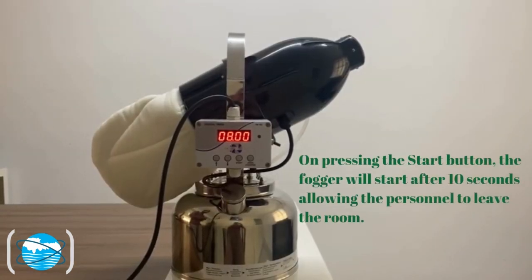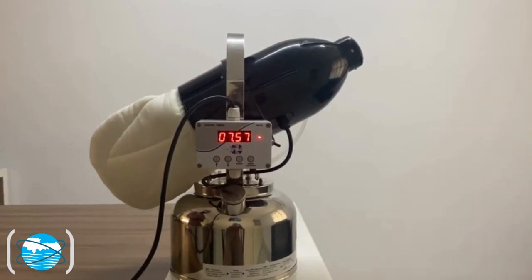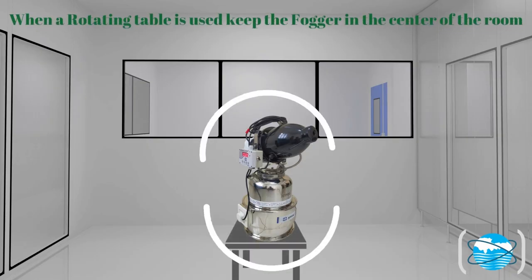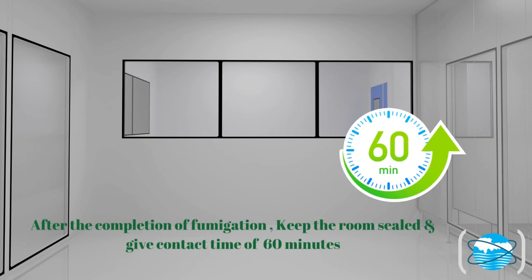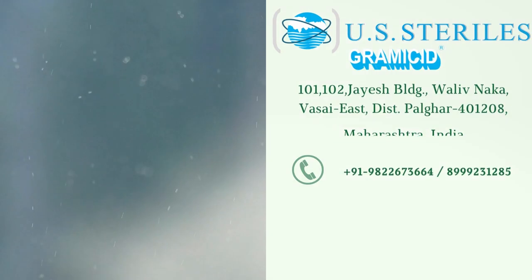On pressing the start button, the fogger will start after 10 seconds, allowing the personnel to leave the room. When a rotating table is used, keep the fogger in the center of the room. After the completion of fumigation, keep the room sealed and give a contact time of 60 minutes. Perform a swab test before and after fumigation with Gramacid Secure disinfectant.